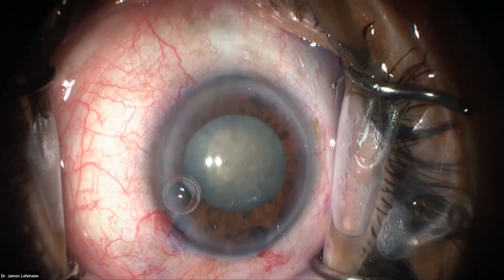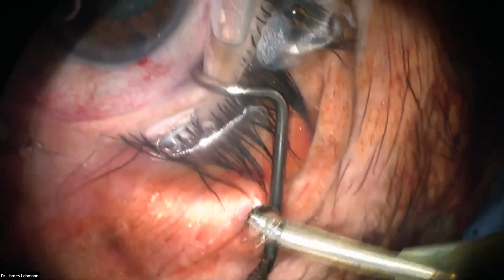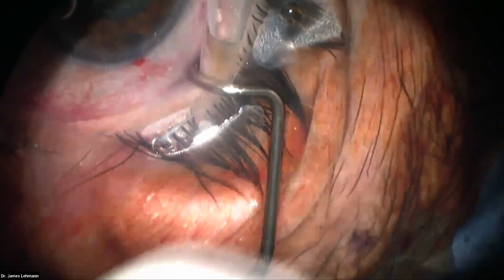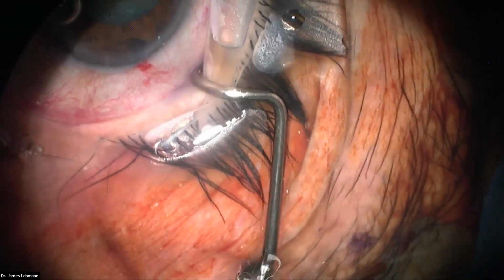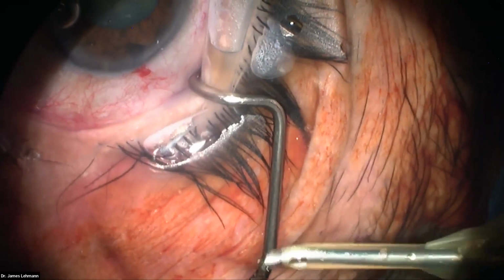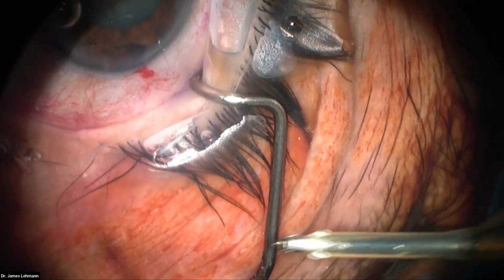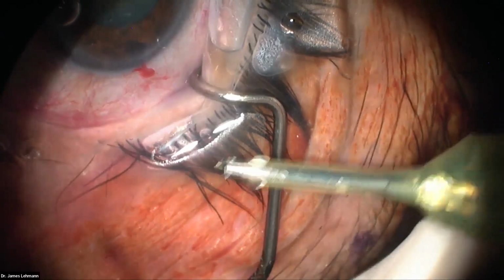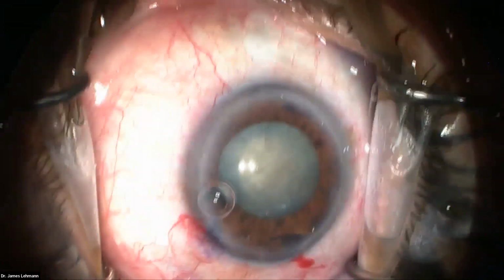So now I got the phaco, and now let's just look quickly at the phaco tip I'm using. So this is called a Kelman tip or a 45 tip. I'm using the Johnson & Johnson phaco machine. You can see that's a 45 tip with a little bit of oval ostium there. And it's 45 degrees, okay? I like that because it cuts very nicely.